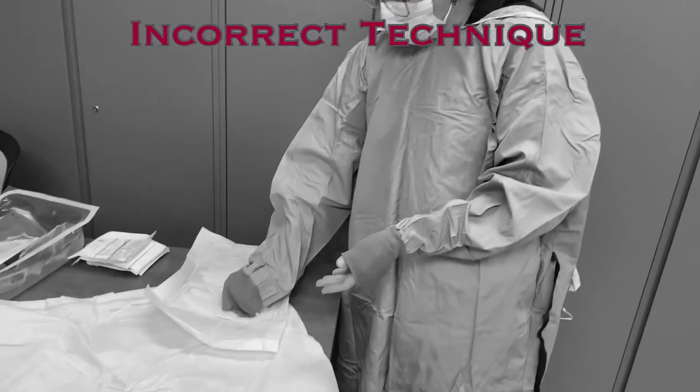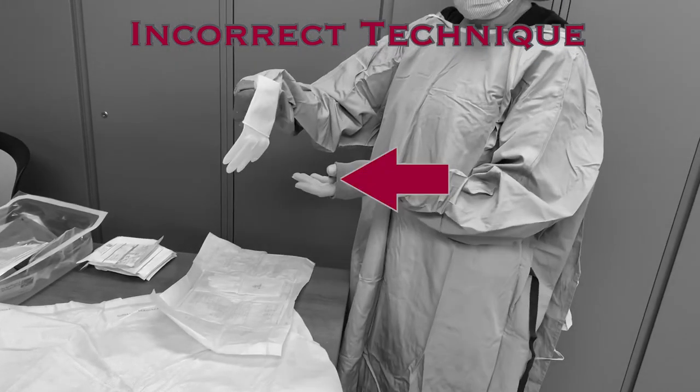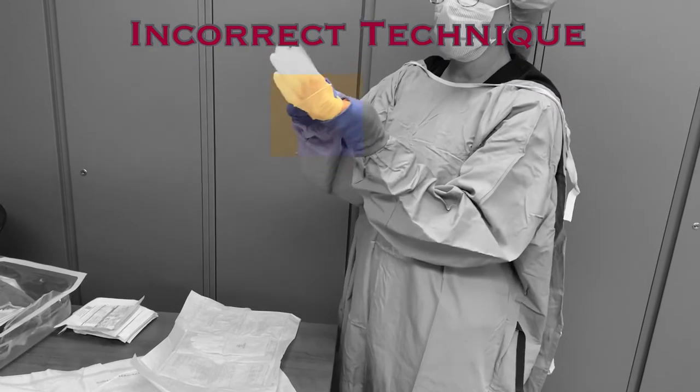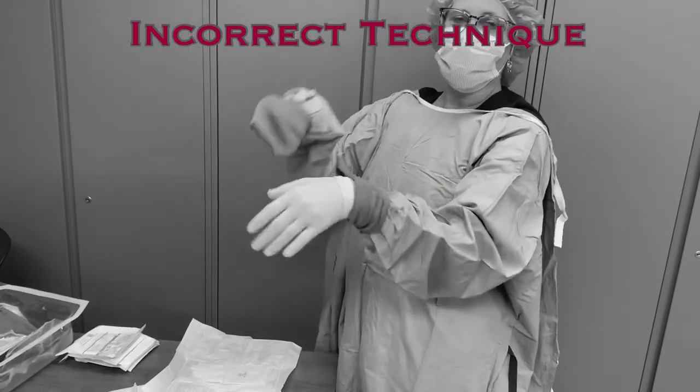Issues arise when hands are not kept within the sleeves. If fingers are extended out of the sleeve, people think it will be easier to don the glove, but it very often leads to contamination of the gown. As the hand is inserted into the glove, the fingers are likely to come into contact with the other sleeve's cuff, causing contamination.